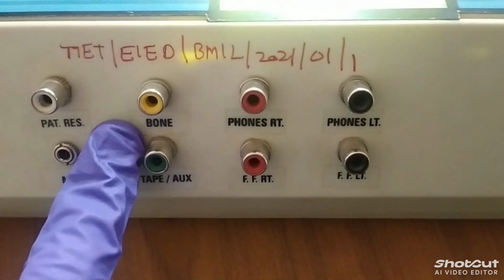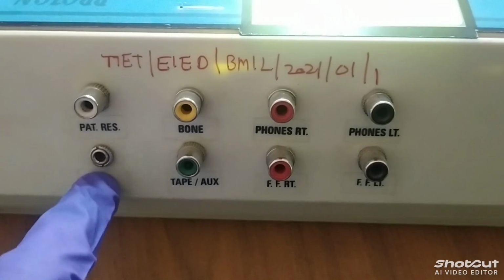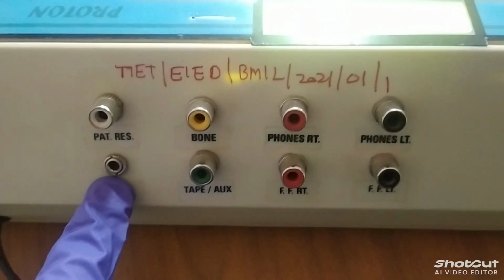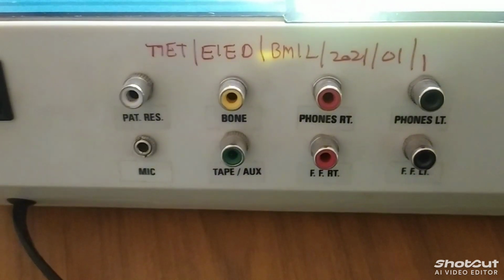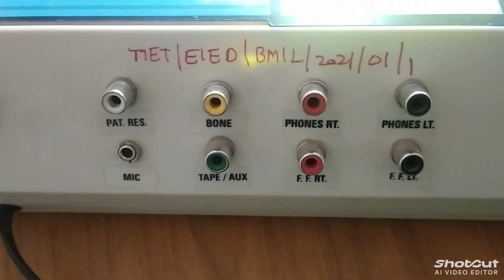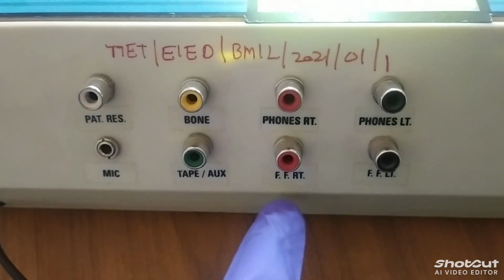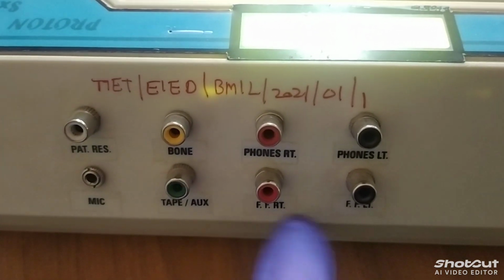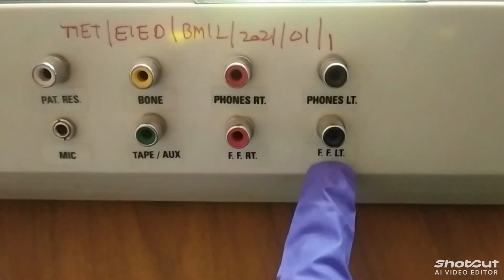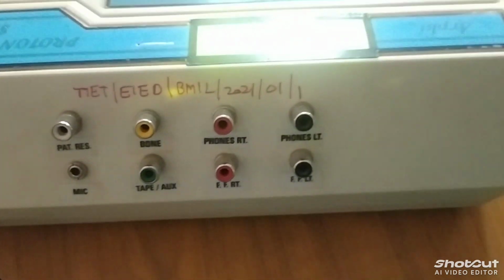This is used for the bone conduction test, and here we connect the bone conductor. And this one is used for connecting a mic for talking over with the patient and instructor. Next are your FFRT and FFLT. FFRT is used for free field right and FFLT is free field left.